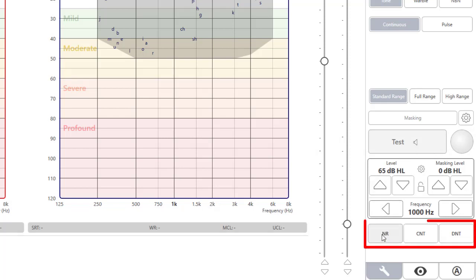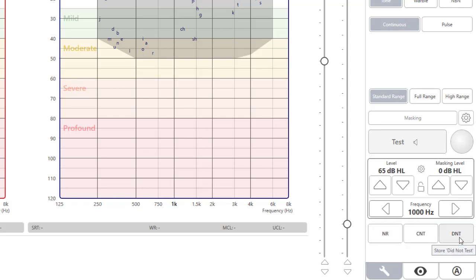Below the level controls, you will find the no response, could not test, and did not test buttons. Click on these when necessary and the proper symbols will be recorded at the threshold and frequency where you are testing.